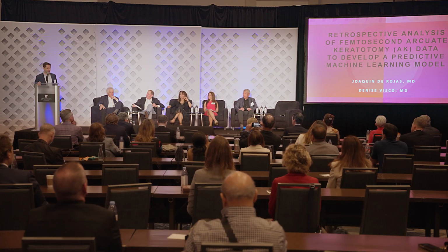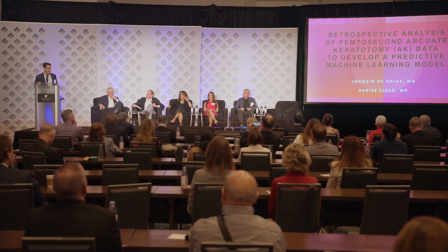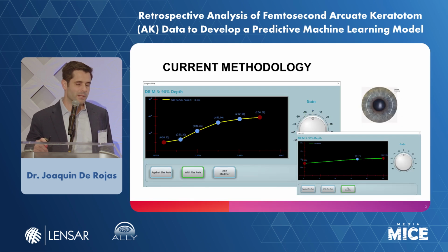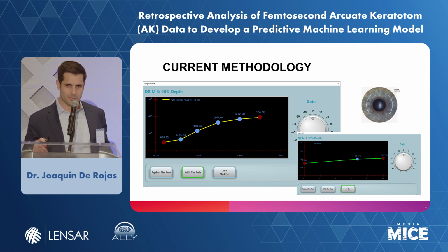The purpose of this project was to see how far we can go with these arcuate incisions, how accurate we can make them. So the goal was to try to use anything at our disposal in machine learning to see how accurate we can make them. And so what I did is a retrospective analysis. This is a line that has astigmatism at the bottom on the x-axis, and it has the arcuate. And obviously, the higher the astigmatism, the higher the arcuate. You look at your data and you adjust these little knobs up and down. And you also have an age factor that you adjust up and down. And that's really what is done right now with the Ally.